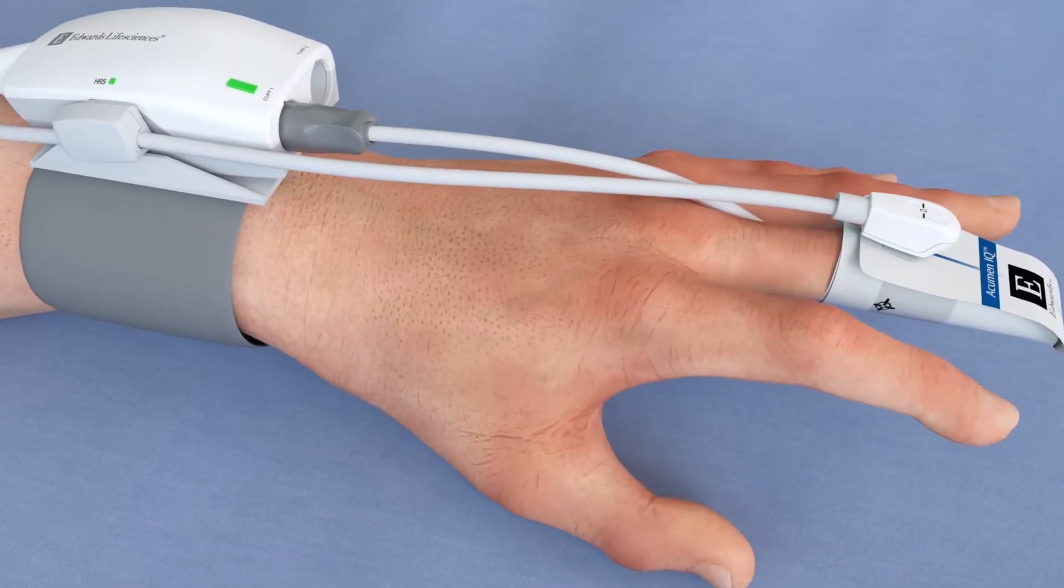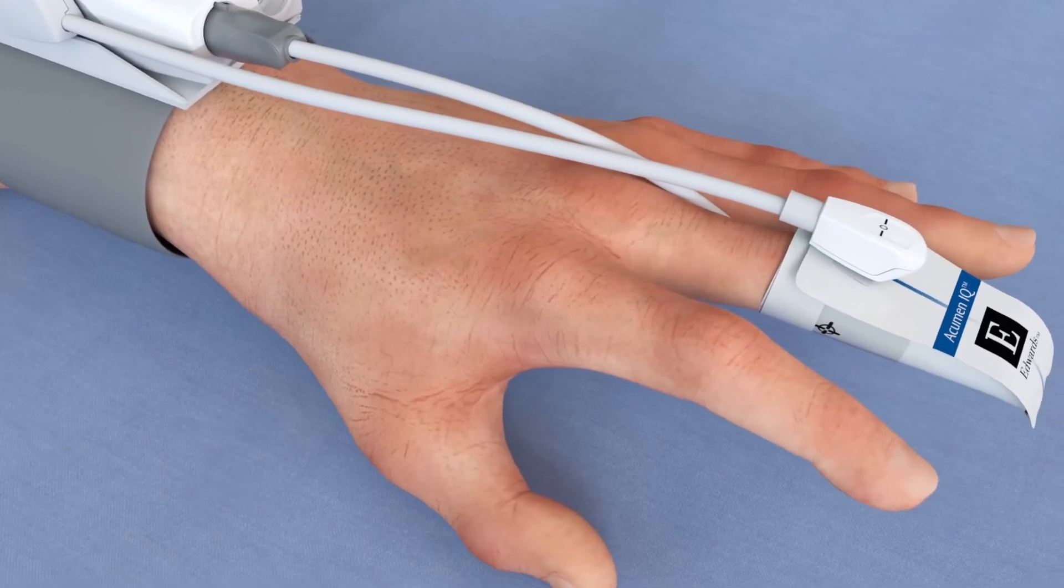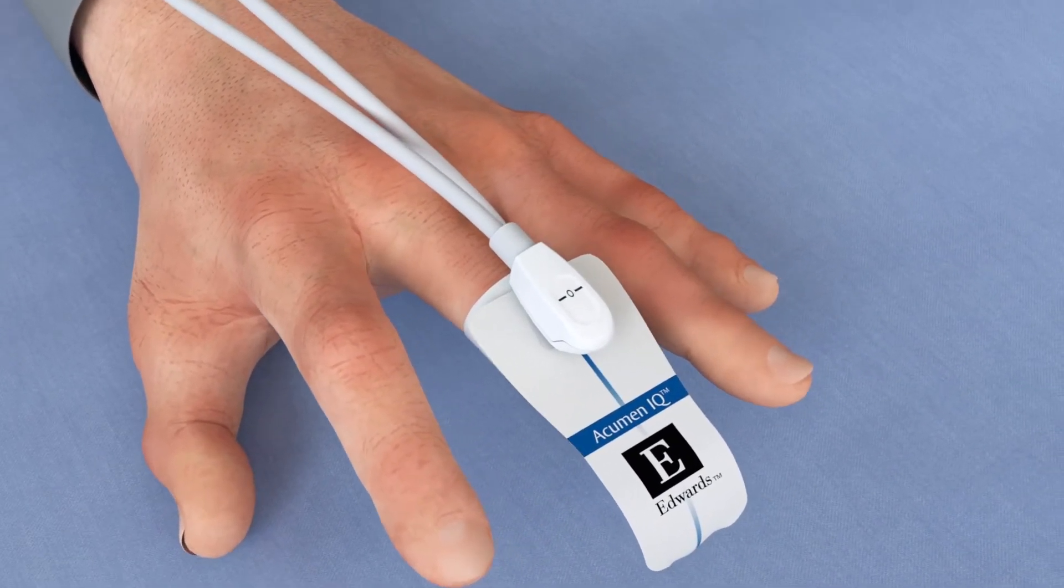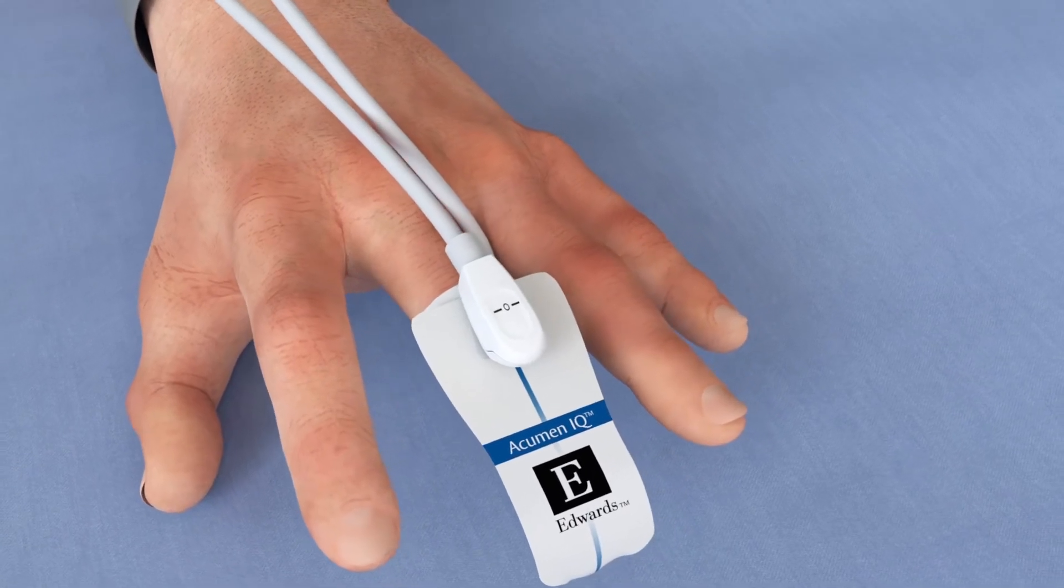The AcumenIQ Finger Cuff is designed for single patient use. Upon starting a measurement, the finger cuff can be used and reapplied for up to 72 hours on one patient.